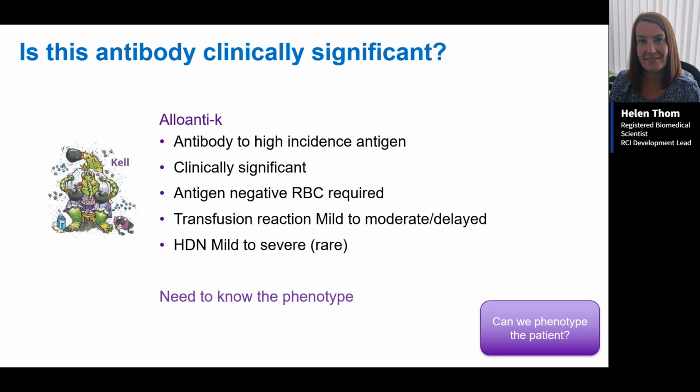So yes, you can phenotype the patient. No, you can't phenotype the patient because they've been recently transfused. And you can't phenotype the patient because they are IgG DAT positive. So I will just give you a minute or so to go over it.